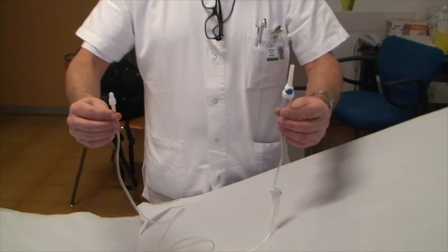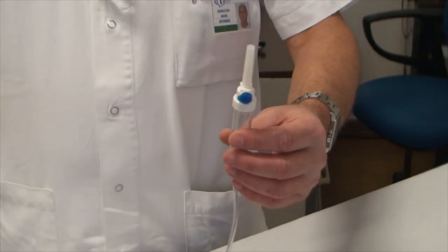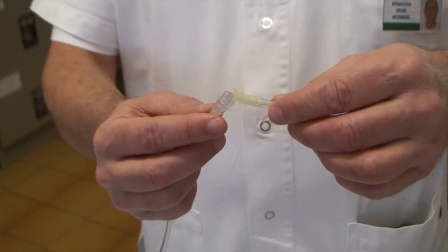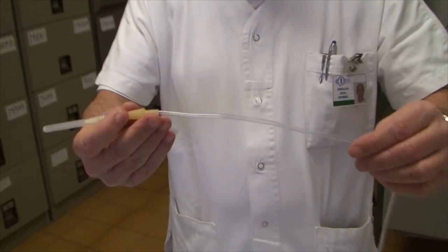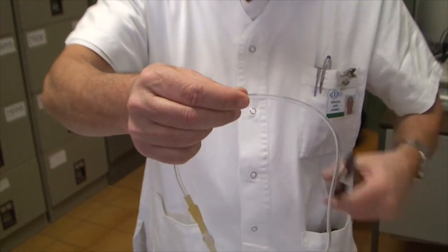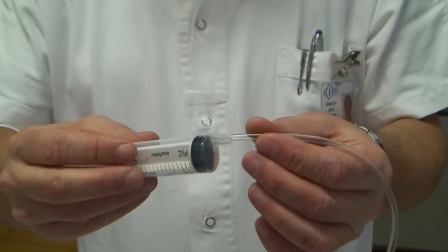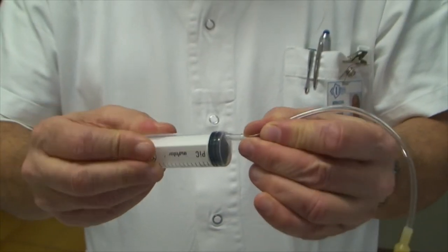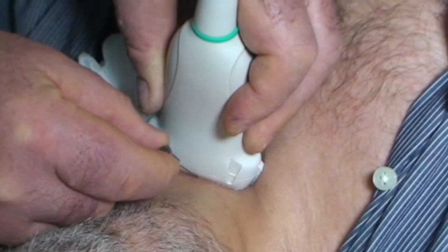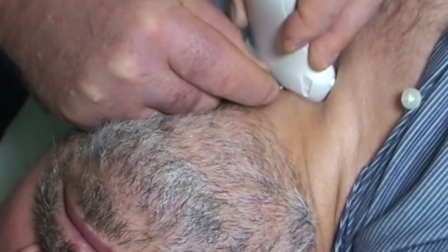If no syringe holder is available, there are two alternatives. The first is to make a homemade tool with an intravenous injection plastic tube; in this case, aspiration is still needed for sampling. The second is to sample by capillarity, without aspiration.